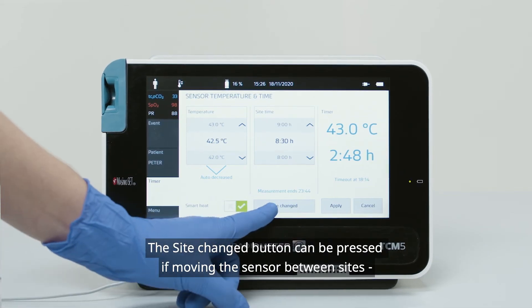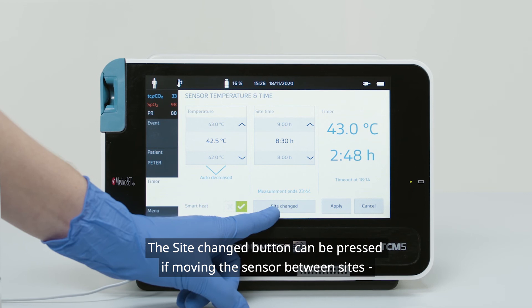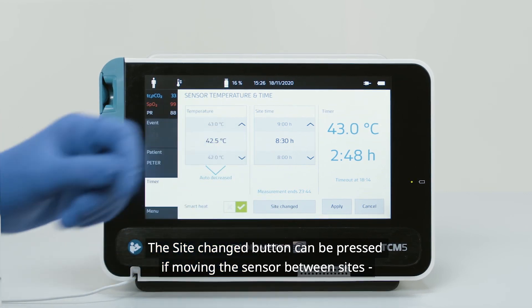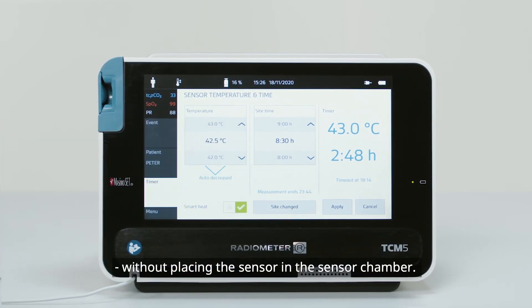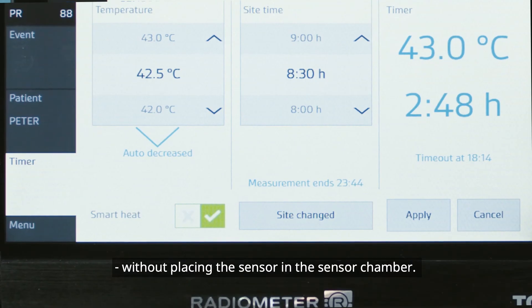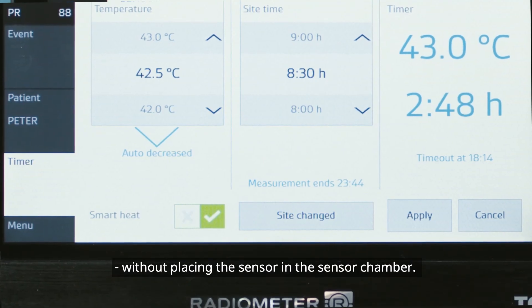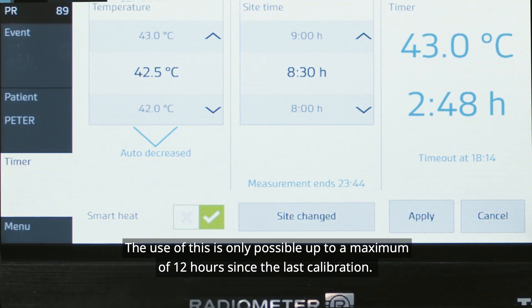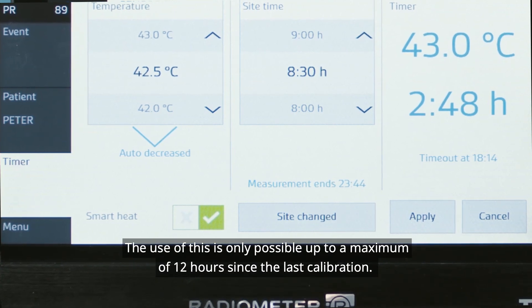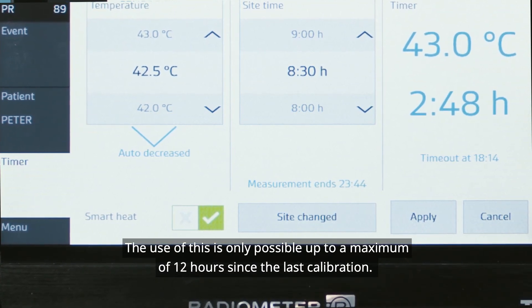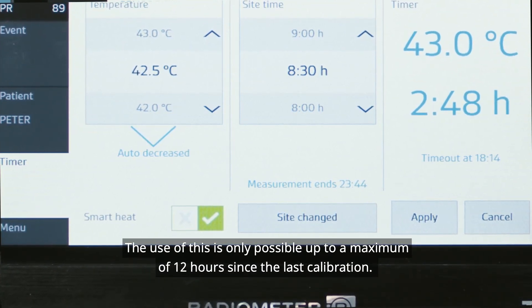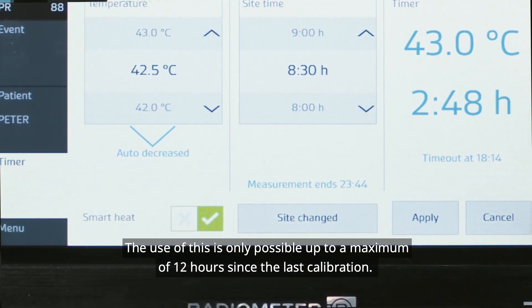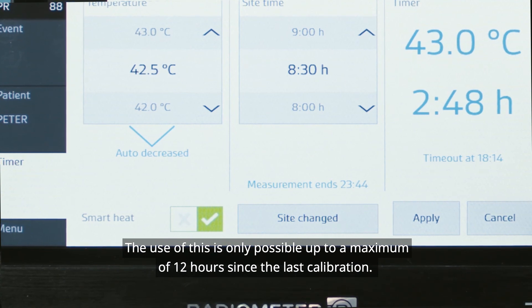The Site Change button can be pressed if moving the sensor between sites without placing the sensor in the sensor chamber. The use of this is only possible up to a maximum of 12 hours since the last calibration.